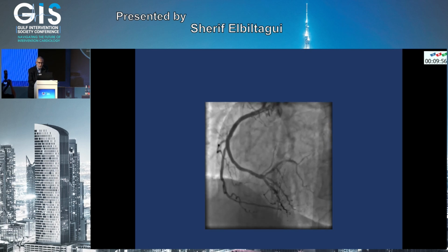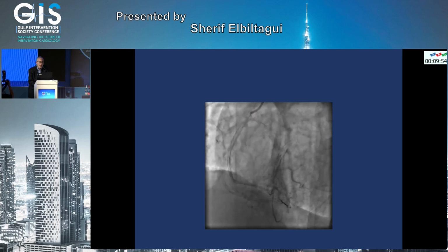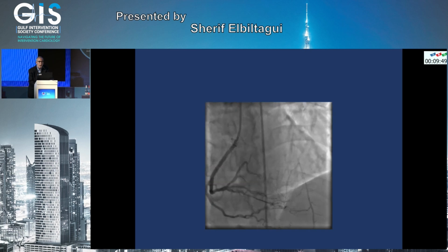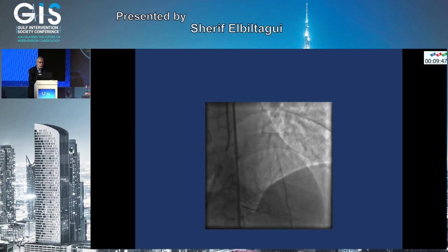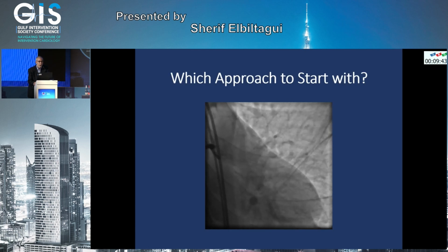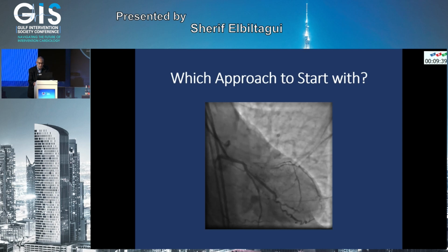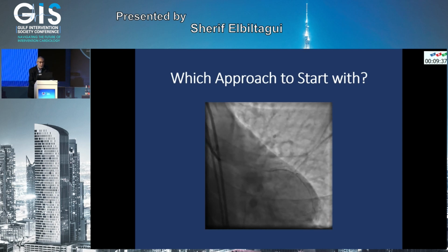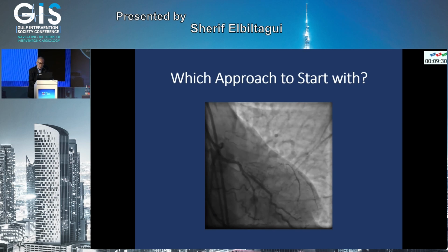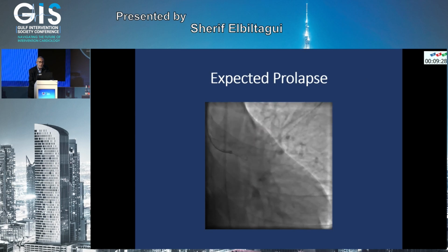And then you can see there are good septals to the LAD, encouraging you to start with a primary retrograde approach, which is very appealing in ostial CTO. But anyway, I thought maybe I'll give a try for the antegrade approach first.